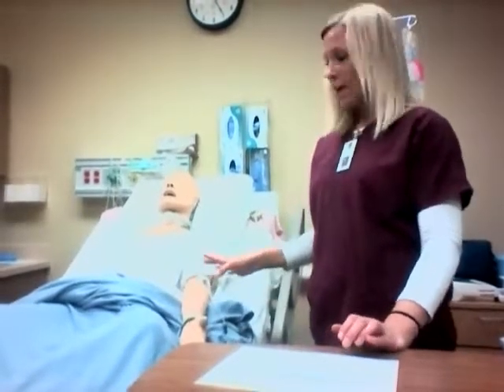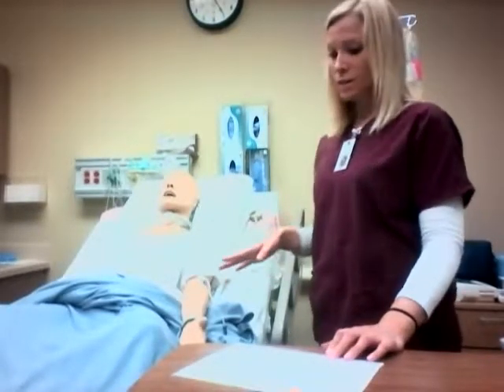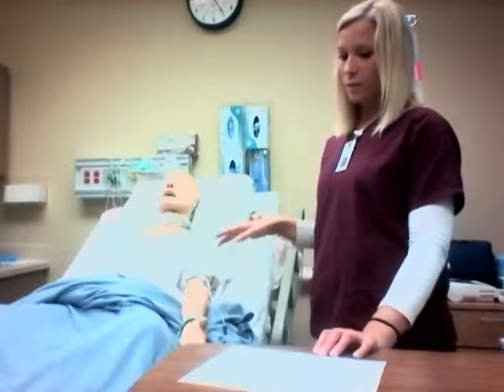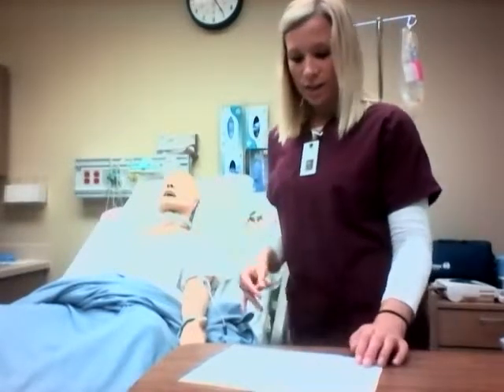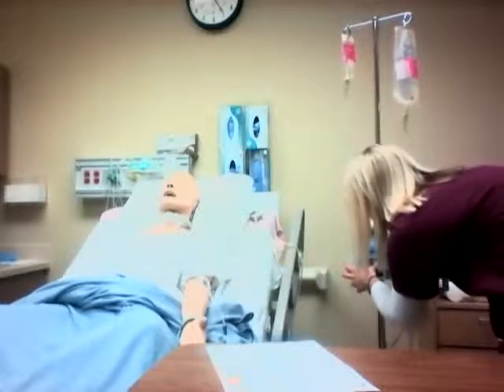And again, Mrs. Smith, if you have any of the symptoms such as chest pain, dizziness, shortness of breath, or dry mouth, please use your call light and let us know right away. It probably wouldn't hurt to check her apical pulse and also her blood pressure. Again, double check that her EKG is set up correctly. So since I've done that, I'm going to go ahead and start my Cardizem infusion. So I go ahead and press start.